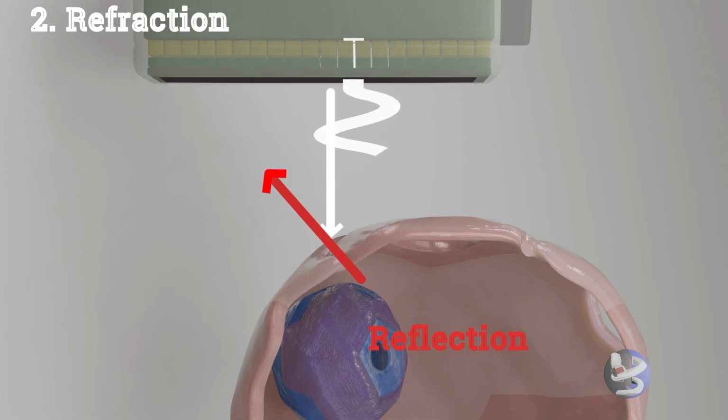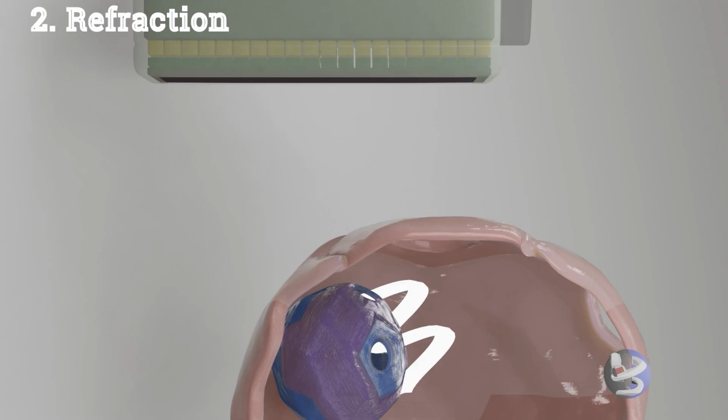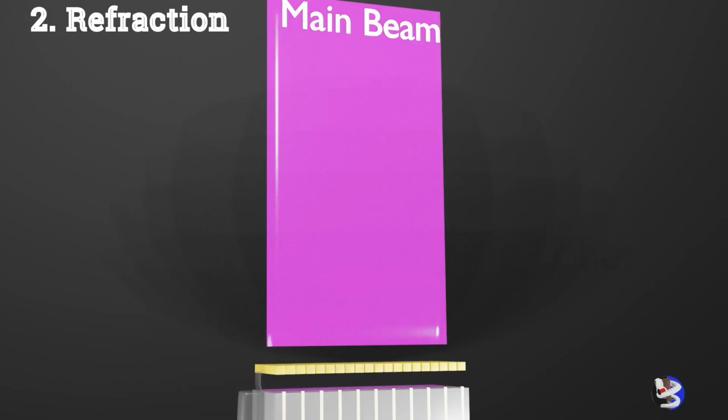If the propagation velocity is greater in the first medium, refraction occurs towards the center, or it converges. If the velocity is greater in the second medium, refraction occurs away from the originating beam, or diverges. The side lobe artifact is an example of refraction.